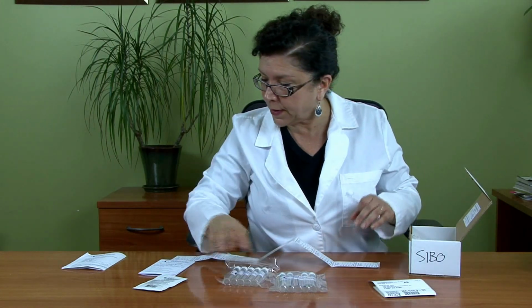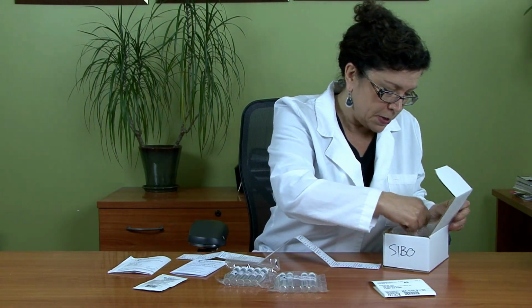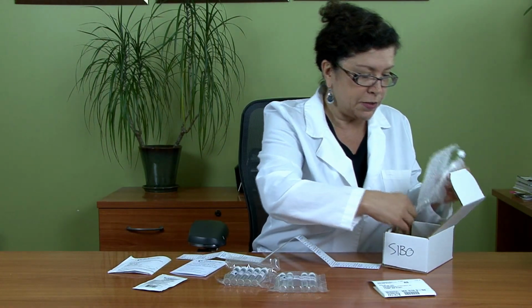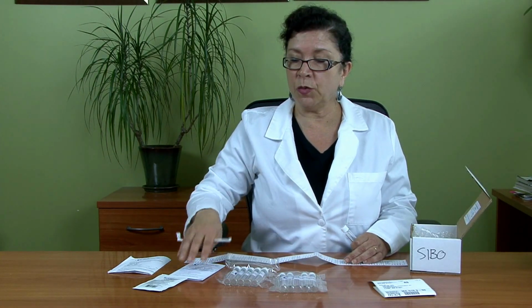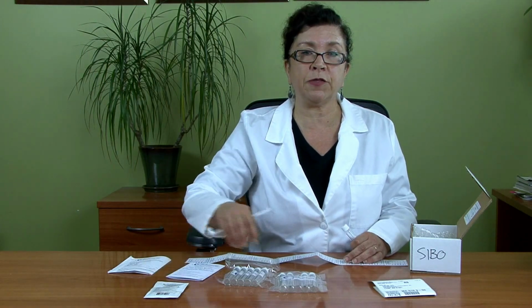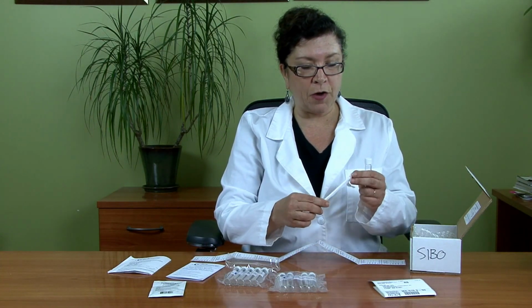We should have in here the straw. So let's get the straw out. So how to collect the actual breath test. So let's talk about the fasting, the baseline. You will not have drank your Lactulose yet. You've reconstituted it and it's ready to go. Okay, so go ahead and open up the straw.